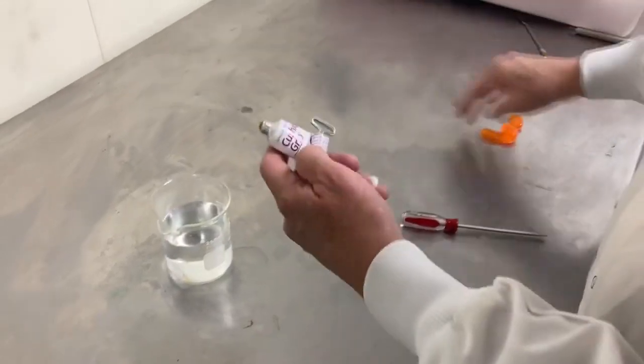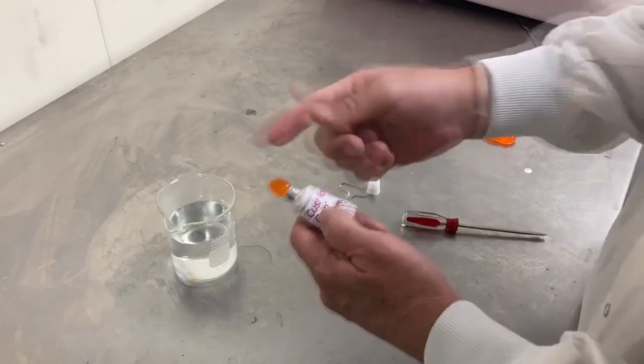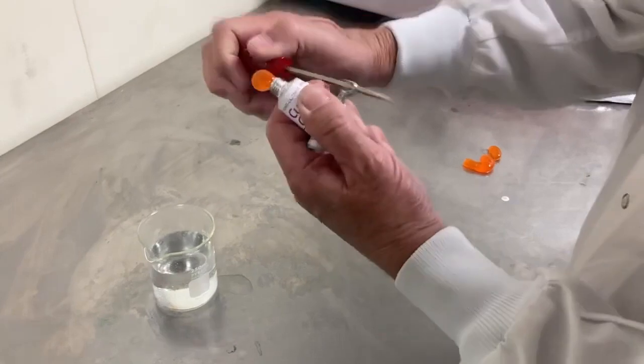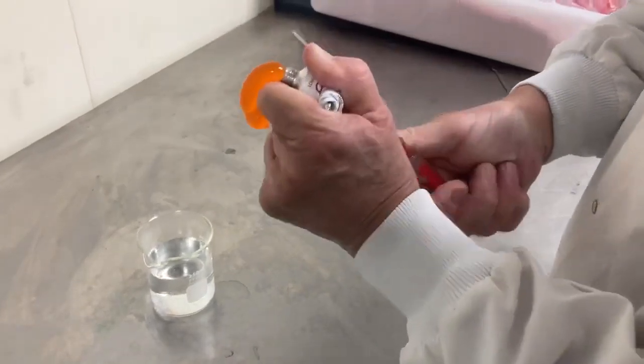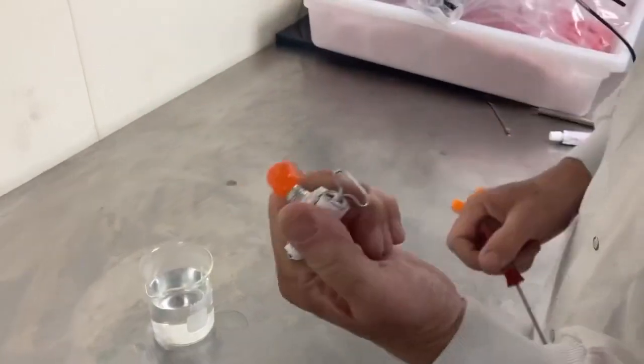When you get near the end of the tube, it might get more difficult. If you experience difficulty near the end of the tube, you can use something to add additional leverage so that you can squeeze out the product all the way to the end of the tube.